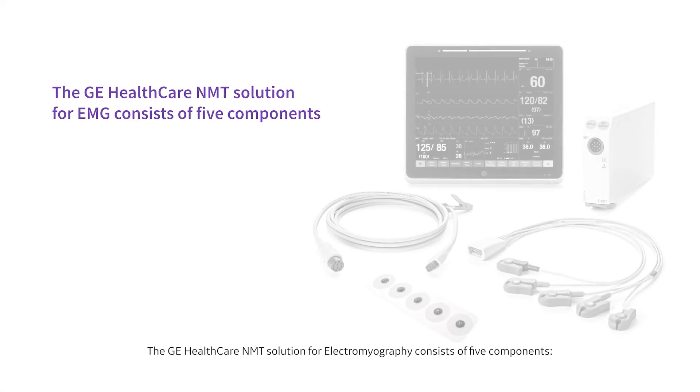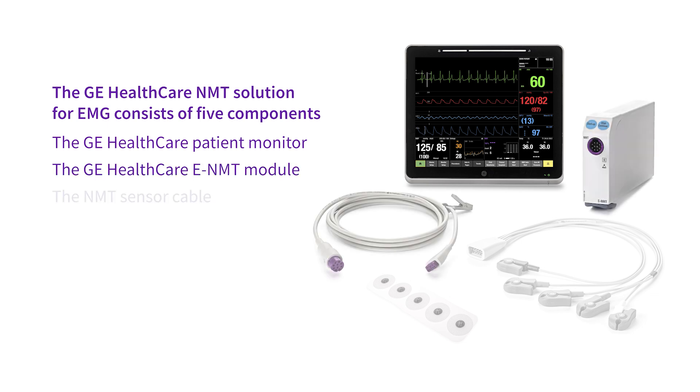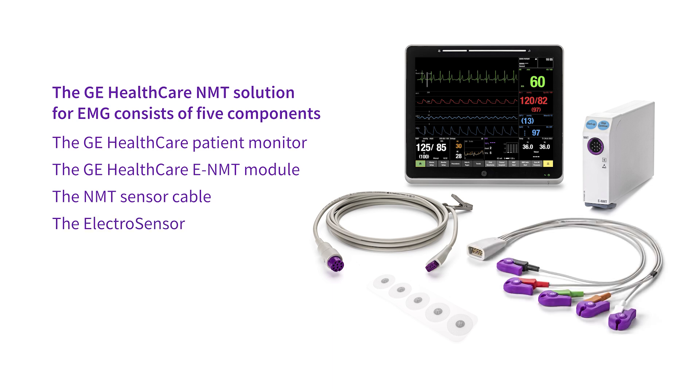The GE Healthcare NMT solution for electromyography consists of five components: the GE Healthcare patient monitor, the GE Healthcare eNMT module, the NMT sensor cable, the electrosensor, and the NMT electrodes.